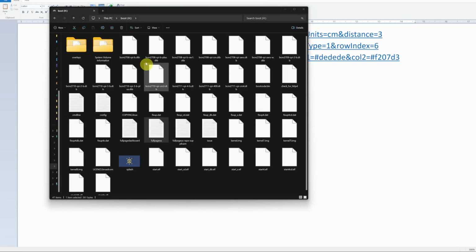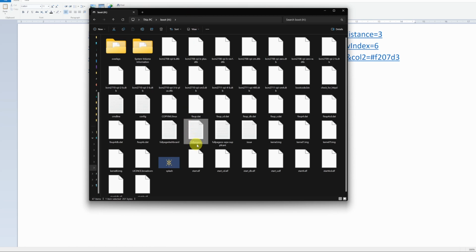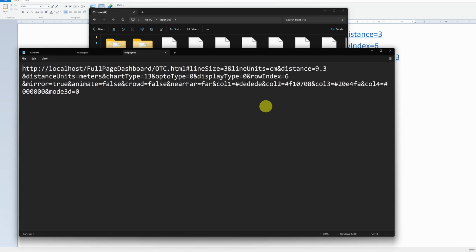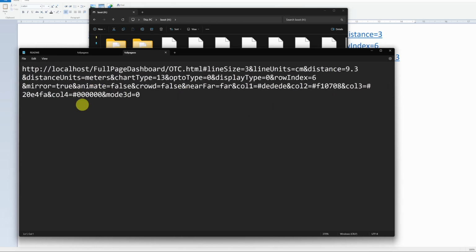So I've put my SD card in my computer. I've opened up the boot folder on the SD card, and you can see here's a file called full page OS, and this is the URL. If I double click on that, I'll just bring up that URL. Hopefully you can see it. I'll try and make it a bit bigger. There it is. So this will be the HTML file that it'll run off, and you can see all these settings. You can see mirror is set to true. You can see distance is set to 9.3 because that's the distance in my room, and the line size at that distance was 3 centimeters. And so this is my setup.